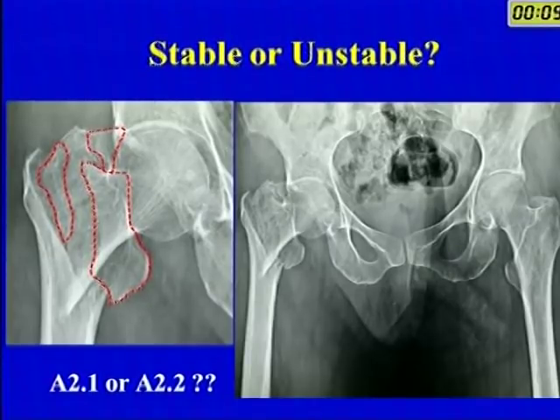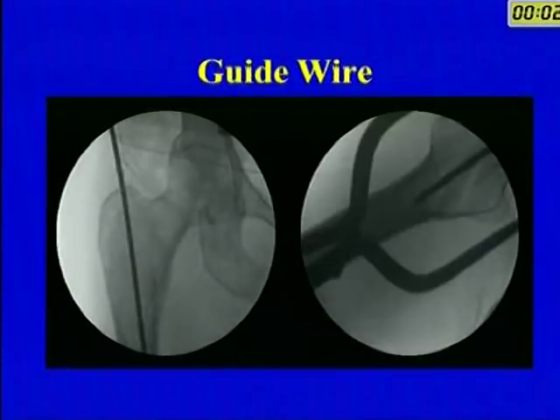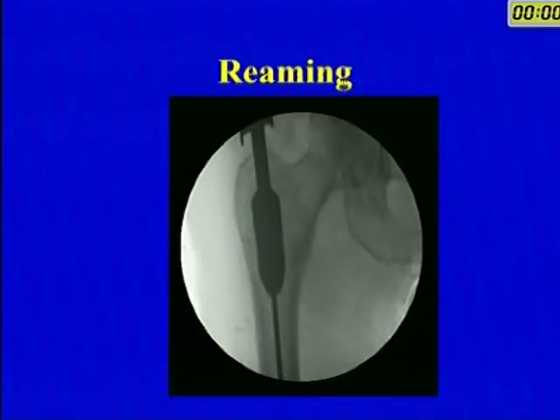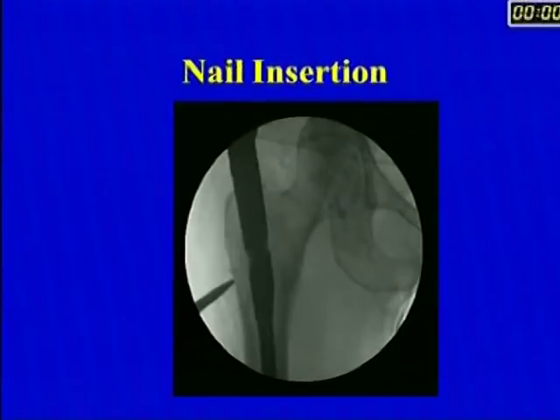So this kind of fracture is probably a good indication for using an intramedullary device like so. Ream it, put in the nail.